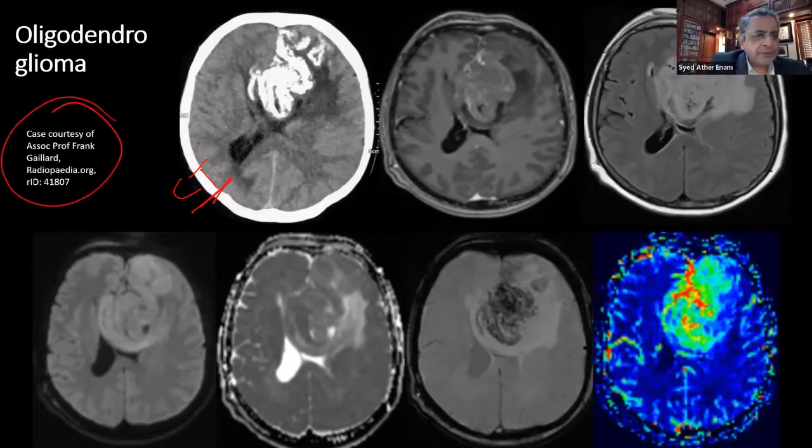That gentleman started Radiopaedia. This is just such an interesting thing, and Radiopaedia is a big thing now. So whatever you guys start, keep at it, and things will come. So keep that in mind. So this is all calcification.